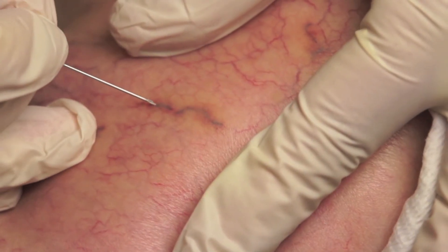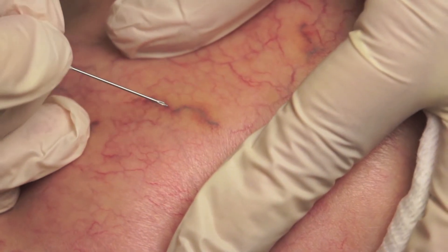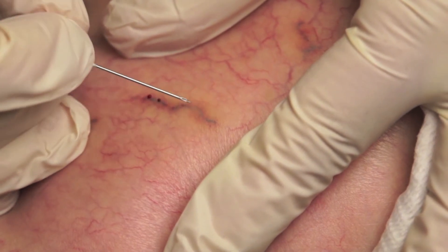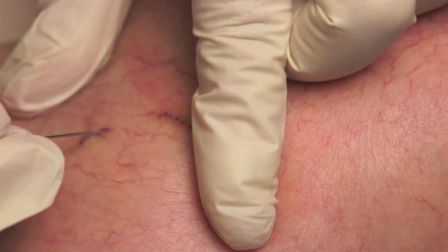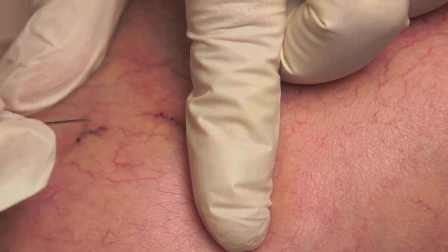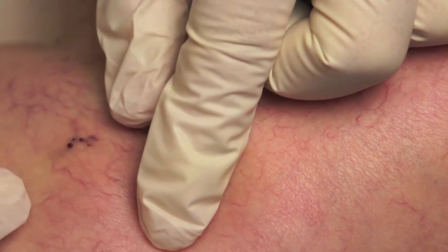An important part of the follow-up of these patients is to see them at two weeks and remove any retained coagulum by needle thrombectomy. This reduces inflammation and reduces the risk of brown pigmentation afterwards.